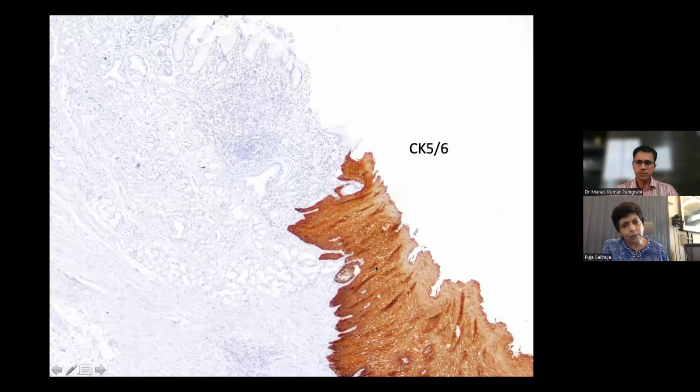Before we go on there, CK5-6 will stain the squamous epithelium, and you can see here it does not stain the glandular mucosa of the GE junction.